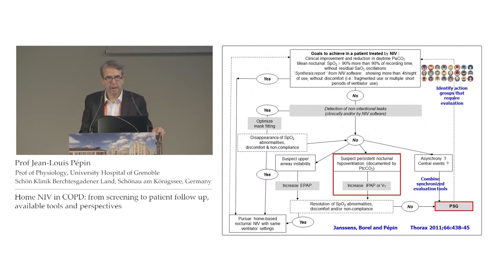This is just to remind you of a flow chart we have suggested with some colleagues in the SomnoNIV group. You have some goals to achieve in a patient treated by non-invasive ventilation: a clinical improvement, a reduction in PCO2, and a normalization of oxygen saturation during the night. And you have a lot of information coming from the NIV software. And now with the action group, you can immediately look at the number of patients that require an evaluation.